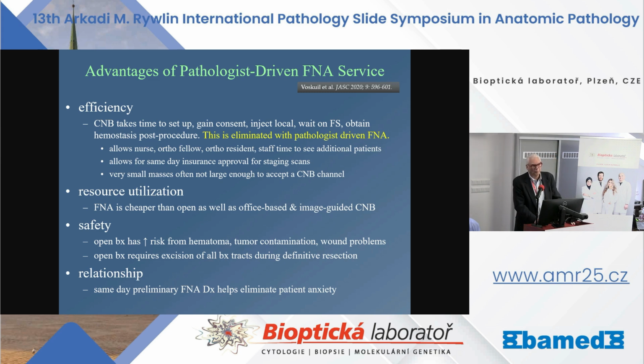By the time they call me and say, "We need to get Wakely over here to do this FNA," he tells the nurse, "Go in and get the patient consent." So the patient is actually consented by the time I get there. I go over the consent form, have the patient sign again, and I sign it. I explain the procedure to the patient. And then I aspirate the lesion.